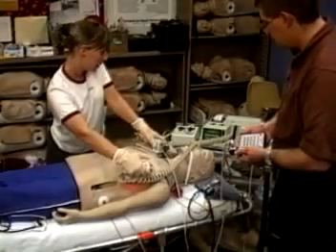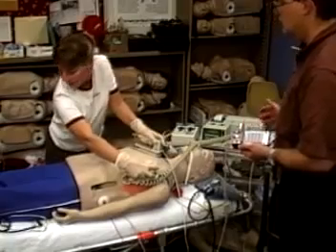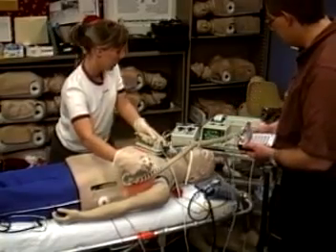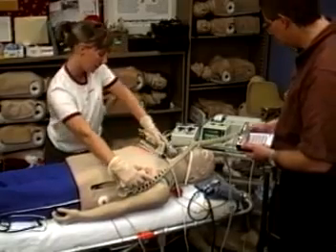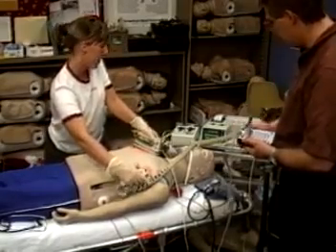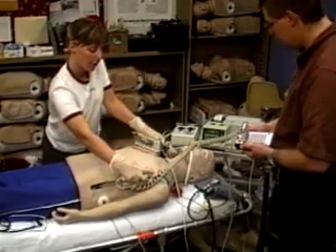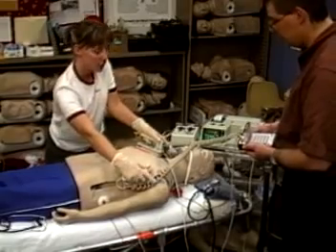The defibrillation chest skin is completely compatible with all manufacturers and makes of defibrillators on the market. An internal load box absorbs the full strength of every shock to protect students and equipment. The load box is designed to handle up to the maximum recommended 360 joules, totally eliminating the possibility of damaging your expensive defibrillator or patient simulator.